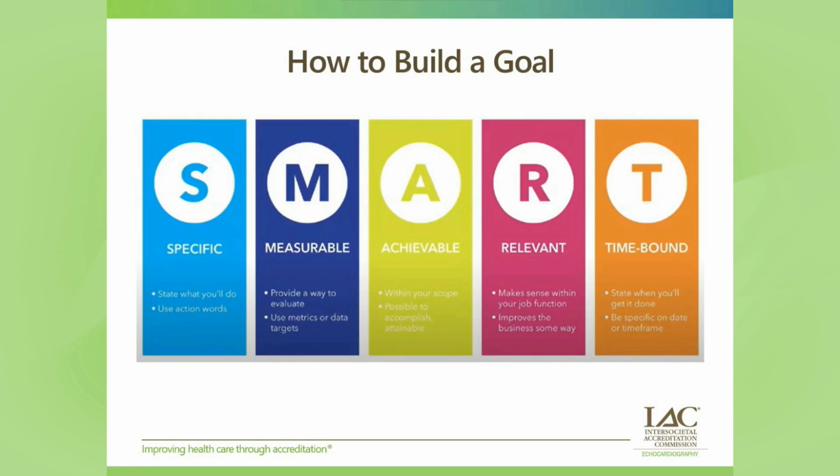So let's use that acronym SMART. First, we're going to be specific and clearly state what the goal is. So we had an 89% interpretive quality score. We'd like to raise that to 92. That's our specific goal. Our quality goal next needs to be measurable. So using the QI tool is a great way to measure your progress once a change has been implemented.